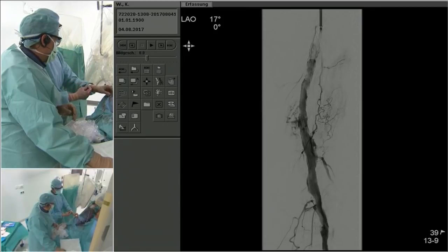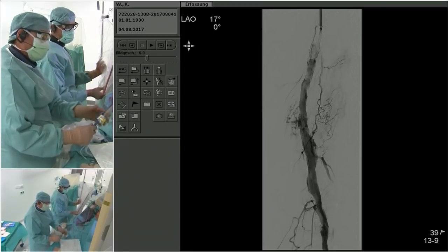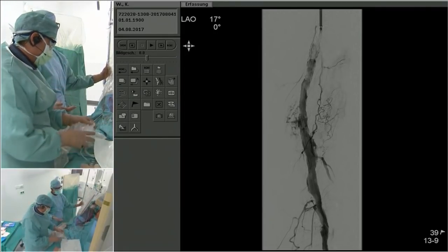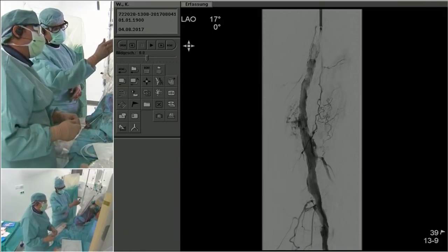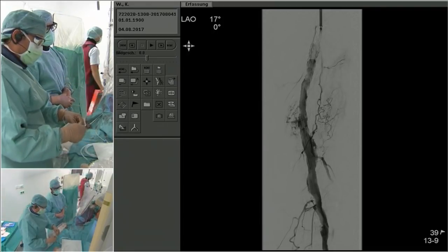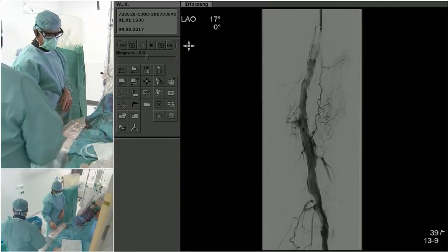So it remains difficult to really find the right end of when you are prepared enough for the Supera and when not. So here the addition of proximal balloon does not fully open, this little bleeding, and also that part of 5-6 centimeters of dilation of the artery, I think are altogether some good reasons to take now Viabahn in.